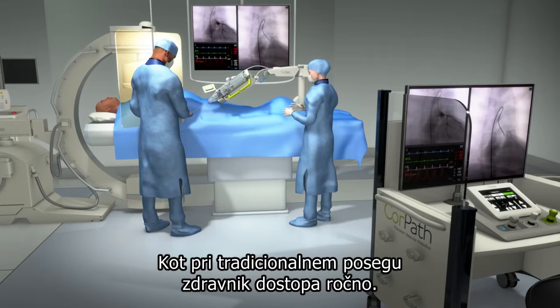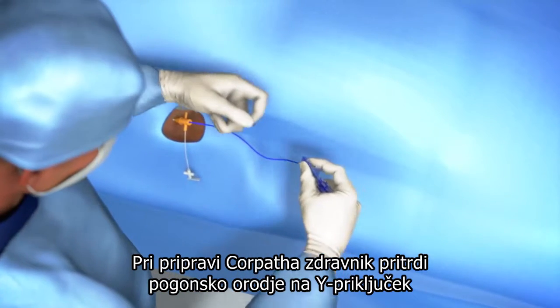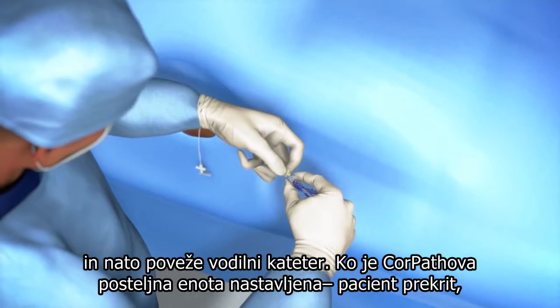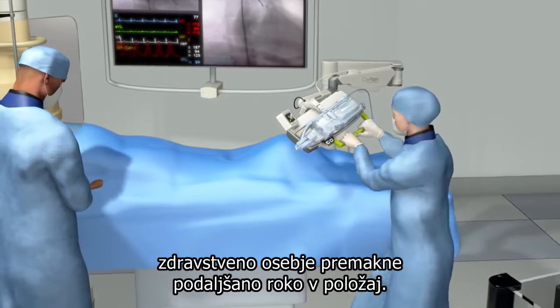As with the traditional intervention, the physician gains access manually. In preparation for CorPath, the physician attaches the drive gear to the Y connector and then connects the guide catheter. With CorPath's bedside unit draped, the Scrubs staff employee moves the extended reach arm into position.